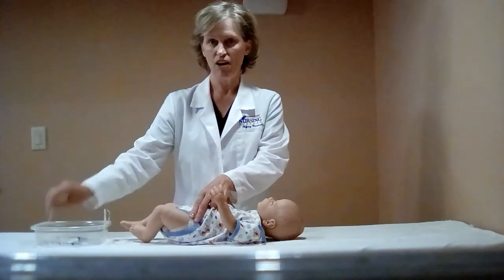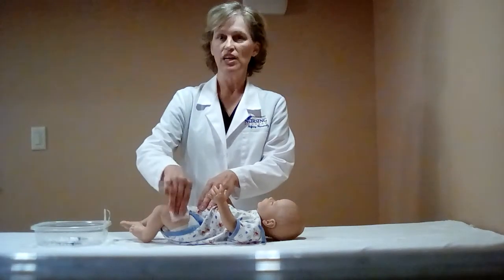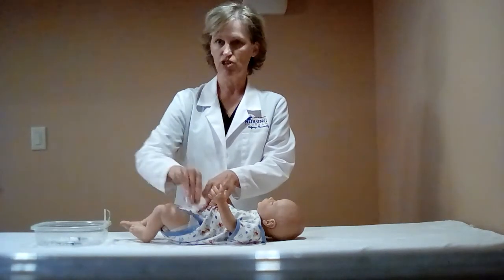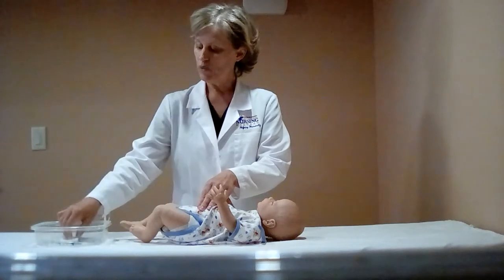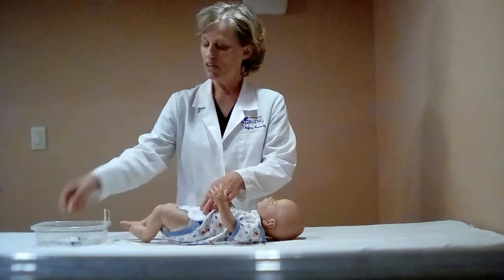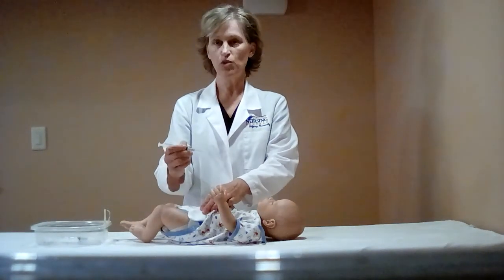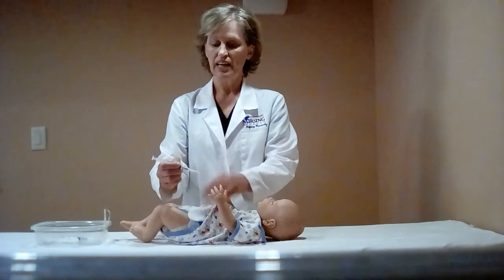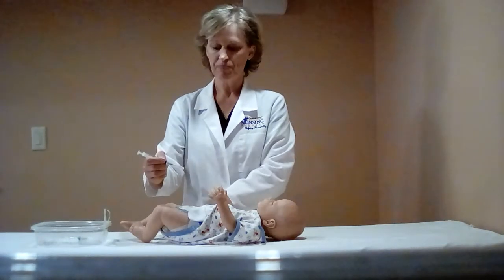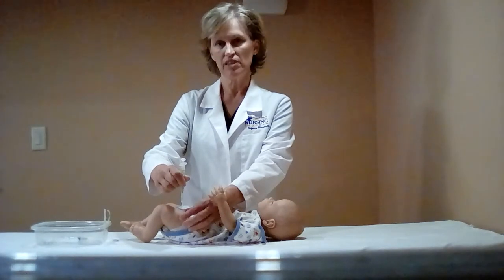Then you're going to take alcohol and you're going to start at the site and you are going to cleanse the area in a circular motion. You will then pick up the 2x2 gauze and place it close to the area. You will pick up the correct syringe and hold it like you would hold a pencil. Then you will remove the cap. You will hold the syringe an inch away from the skin.